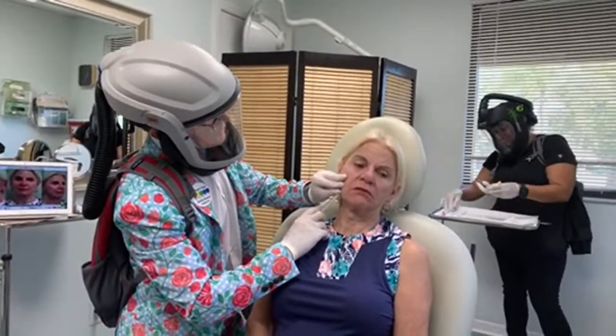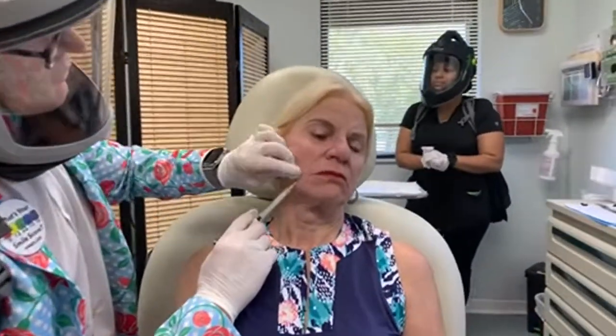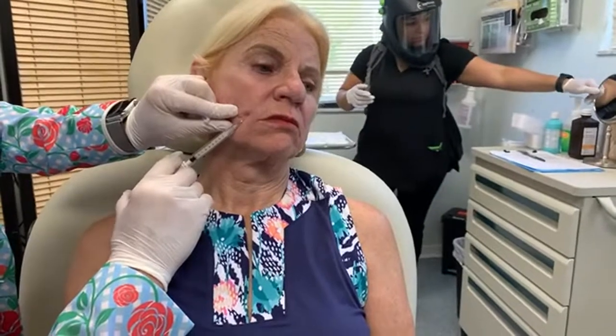Well, that's good. So this is an intradermal injection, and you can see the little creases. They do improve. And I'll use the shiver technique because that allows me to get a small amount of the filler over a large area. So there are a few mechanisms at play here. Number one, we are mechanically, physically widening the skin, thickening the skin to try and thicken the crease. Number two, there's collagen stimulation from the Bellafill, and that collagen stimulation will help a little bit with the creases. And then just more volume will flatten out and plump some of these creases.